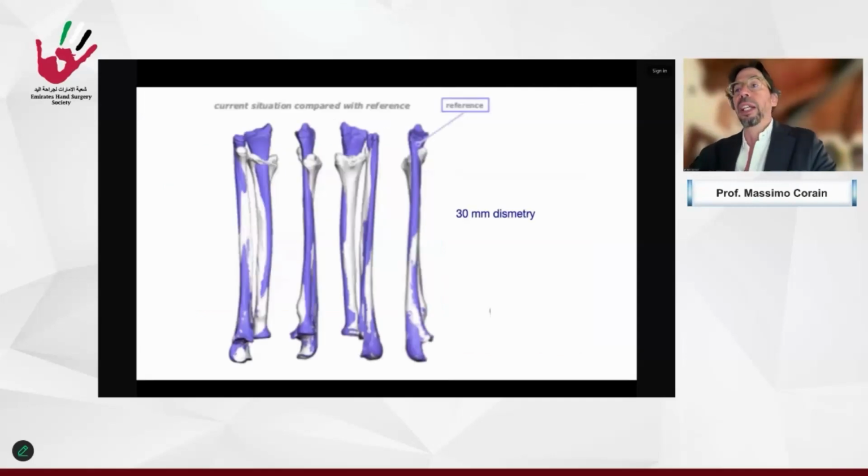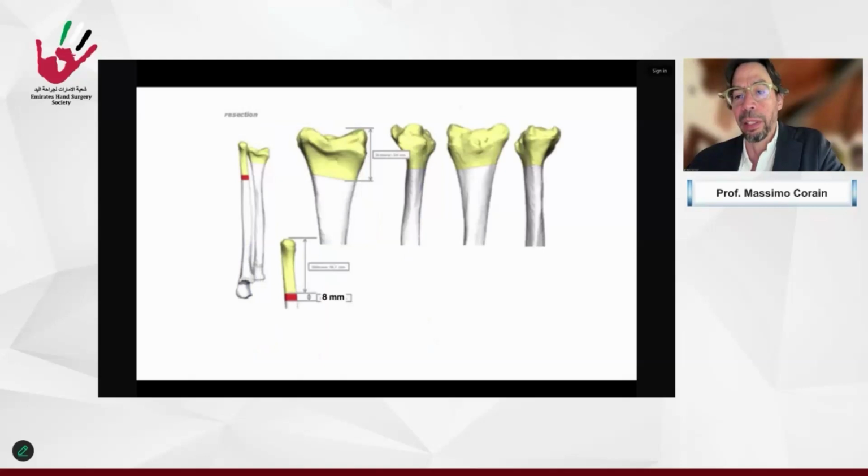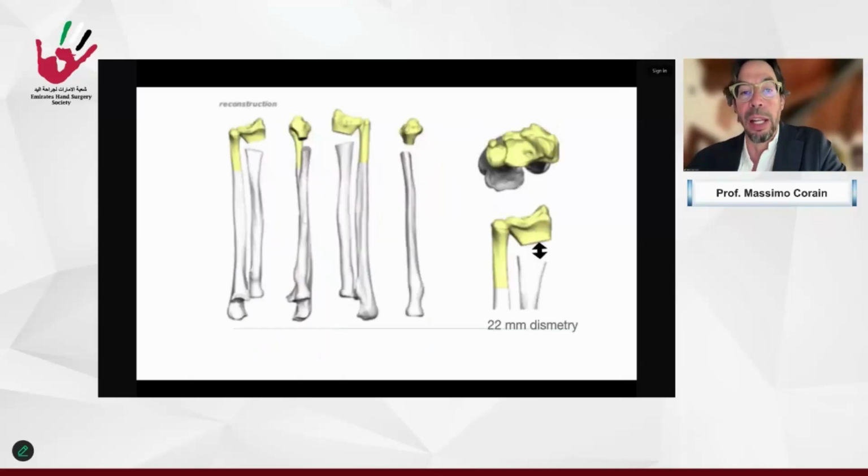And during these 3 years arrived the digital evaluation, the patient-specific implants. So we can see the similar case with a digital reconstruction. And comparing with the contralateral forearm, we can check 30 millimeters of dysmetry. So I decided to associate an ulnar shortening in order to reduce the gap of the distal radius because of the soft tissue retraction, and a distal radius lengthening in this way of 22 millimeters.